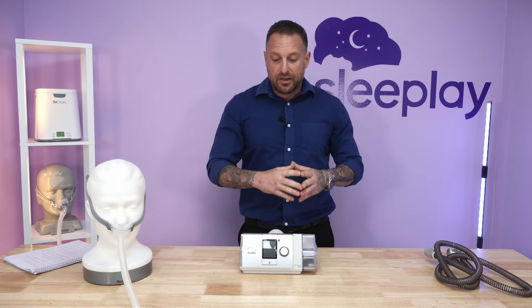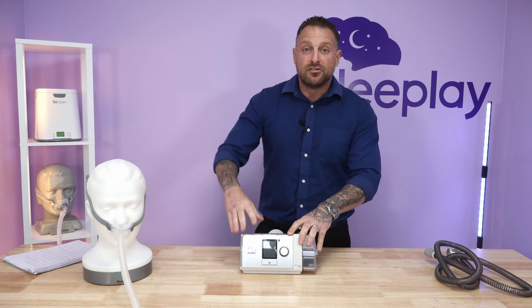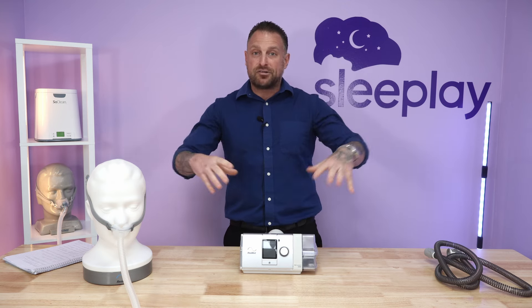Some cases where BiPAP would be used include acute respiratory failure and COPD. It's helpful in patients with pneumonia, and for patients with more central apneic events rather than obstructive events, a BiPAP machine would typically be provided. We'll get into this today.